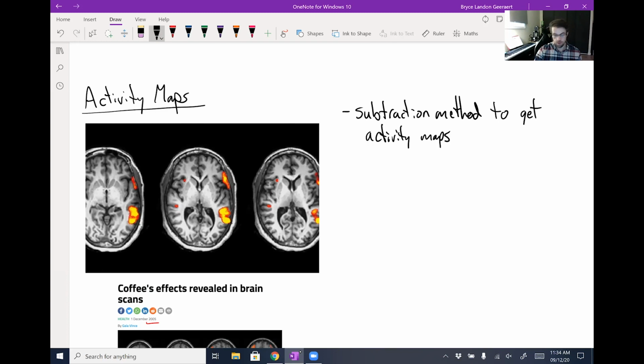So once we've got a sense of what our reference state looks like, which is generally a T2 star weighted image, acquired as quickly as possible using gradient echo, we take our reference image and then we subtract our active state, whatever that might mean, whether it's a thumb movement or this language task or whatever. And actually, I'm going to call this task, just to distinguish it from activity.